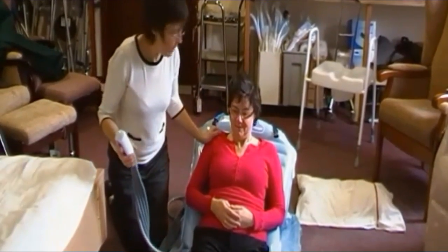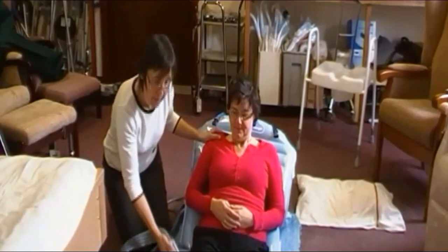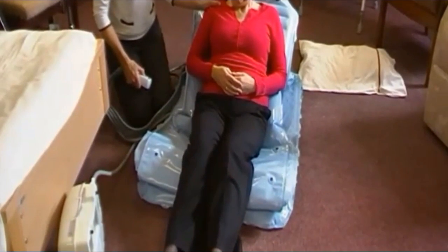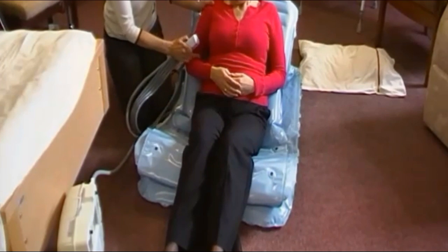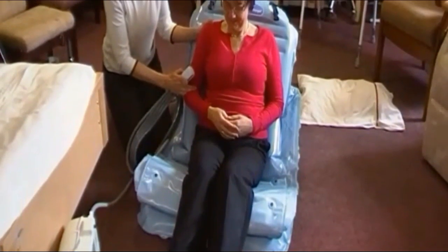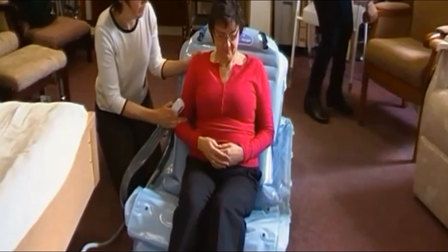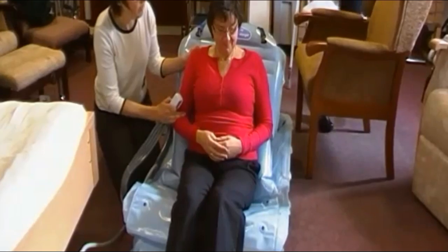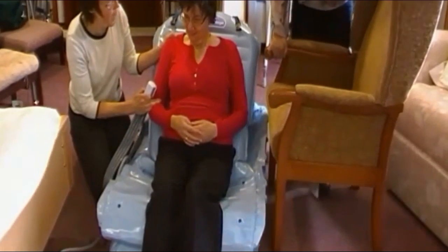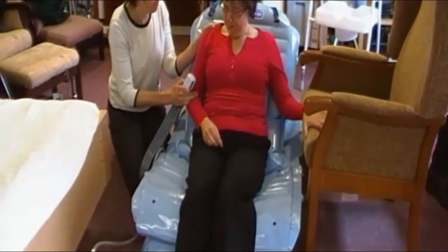Right, now particularly with a larger person, if you don't sit them right up, if you press your second button, that will sit her into a little dip and it will prevent her falling off the front of the cushion. And then you'll start to lift. How are you feeling? Fine. Now would you like to bring a chair and just put it by the side of Christine? This always helps the person to feel a little safer. If you'd like to just put your hand onto the chair. You feel alright? Yes, it's nice and firm.